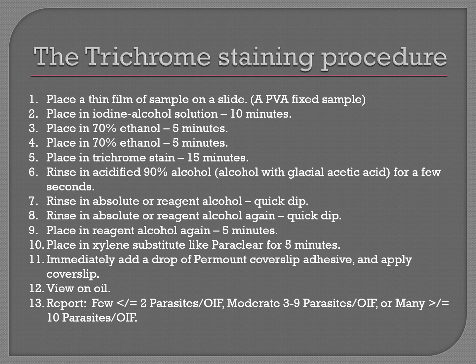Then we're going to place it in a xylene substitute like Periclear for 5 minutes, and what that does is it gets rid of a lot of the debris. Immediately, while the slide is still wet, we can add a cover slip and apply it permanently. Once the cover slip is on, we can view our trichrome stain on oil, and then we report out parasites. We report them out as few, moderate, or many, or none.